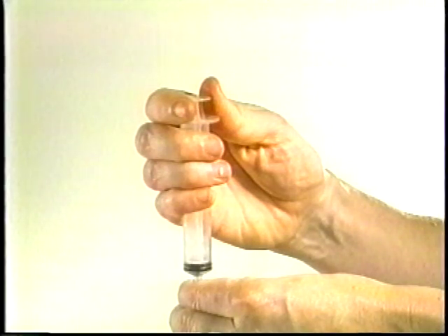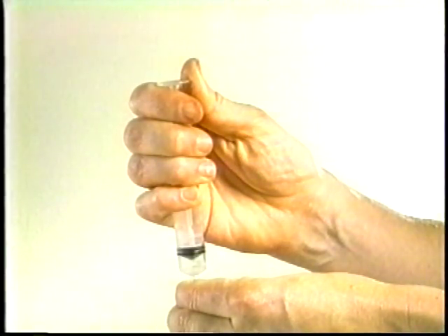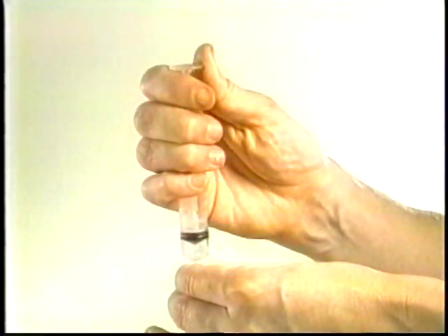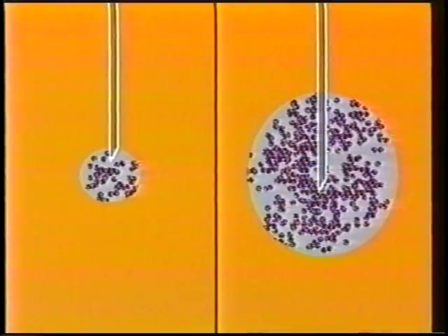In this position, the plunger can be easily pulled back and held in place during the sampling. Remember that a small amount of suction is enough. With the suction in place, the attention can now be turned to collecting the sample by moving the needle back and forth.